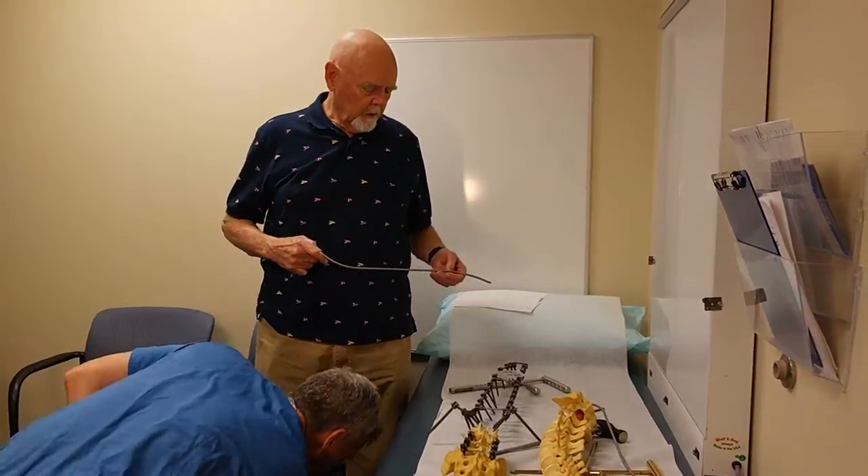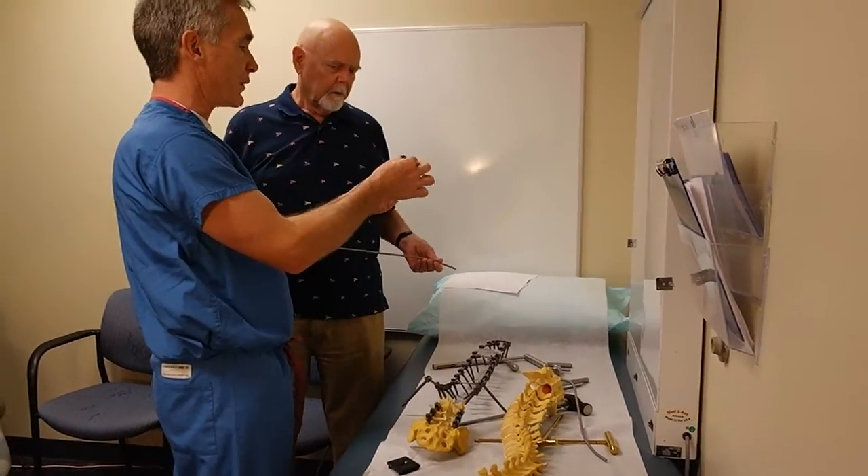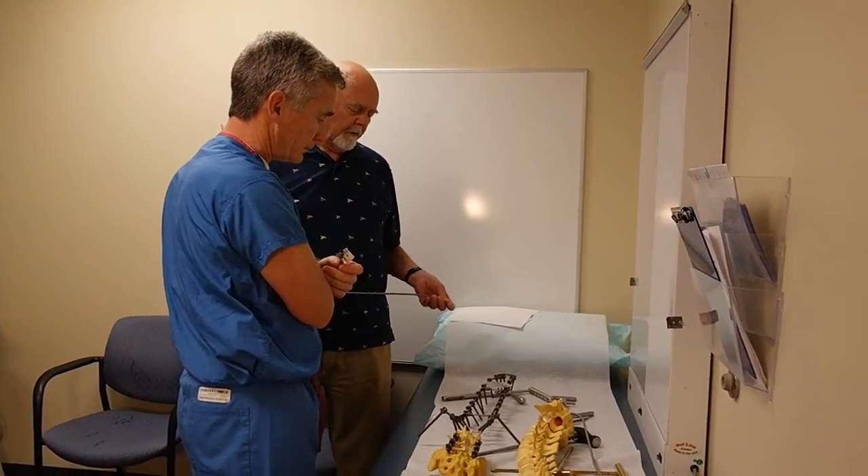The fact that it swiveled some helps you align. Exactly — this has a swivel head on it, and that allows it to align better. I finally figured that out — it had to have a swivel on it.